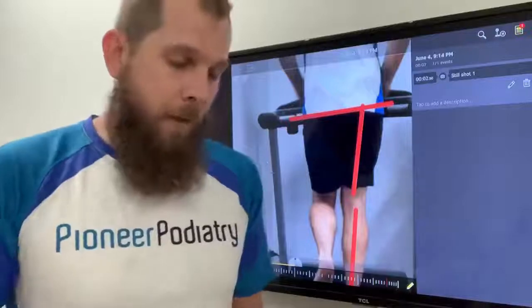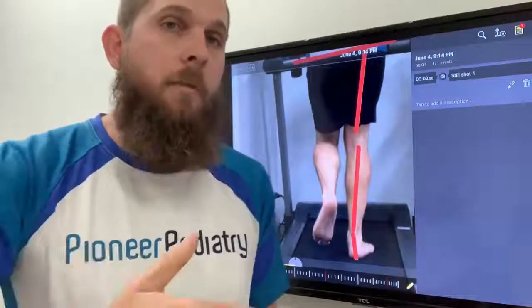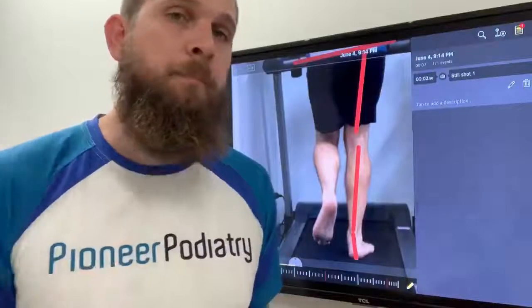So it allows us to assess not only what the foot is doing, but the rest of the body. And then we can provide that feedback to our colleagues who are working higher up the kinetic chain, higher up into the knees and hips as well.